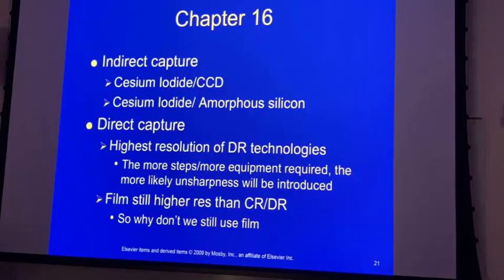So the X-ray exposure on these liberates the electrons based on how much X-ray exposure they receive, right? So again, back to the ribs versus the lungs example. The lungs being easier to penetrate, they're going to receive more X-rays, so they're going to liberate more electrons that are eventually going to feed into the system to create a darker image than what you're going to see behind the ribs, all right?